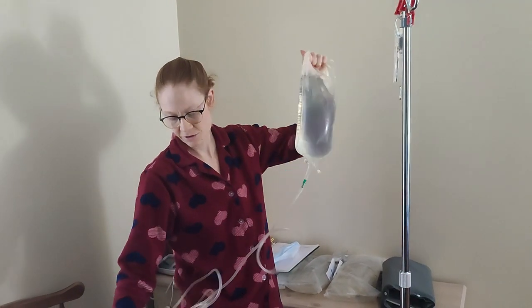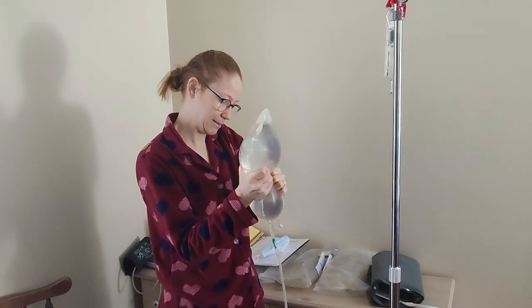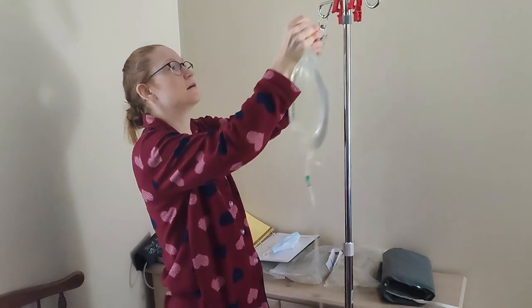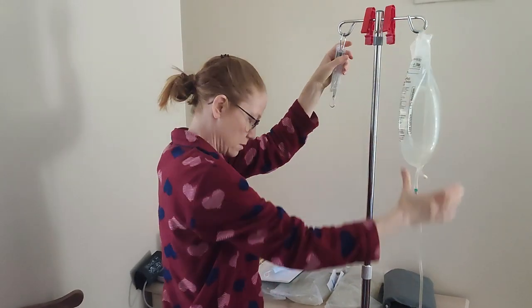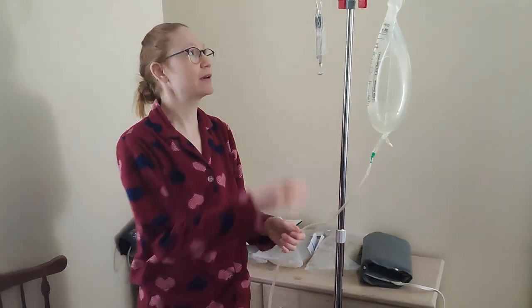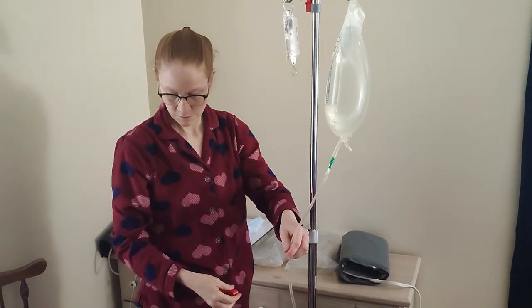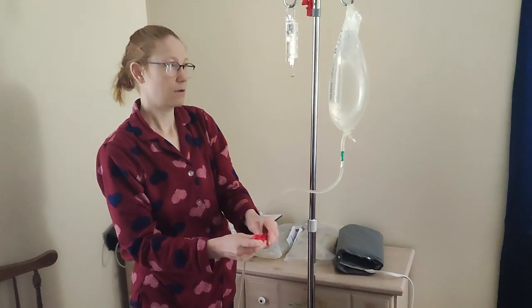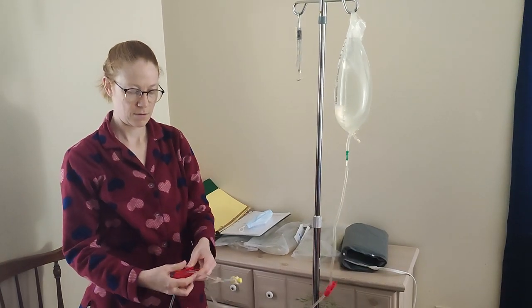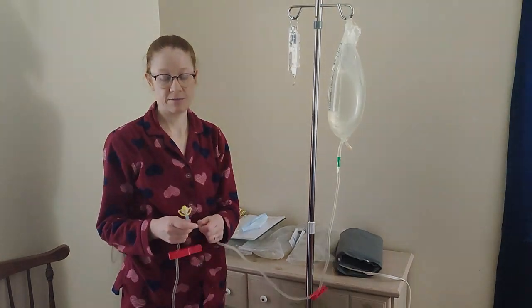I get this open — I have another video that goes through this in a little more detail. Squeeze it, check it, and I'm going to hang it. Now I'm going to prep this and get it all ready to go. I'm not going to show the rest of this getting ready; I'll be back after I do my two-minute hand wash and I'm ready to hook up.